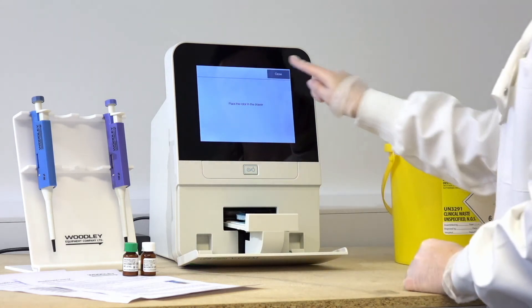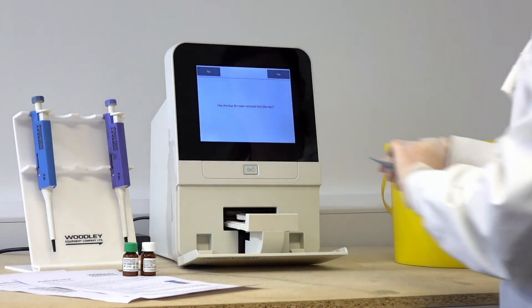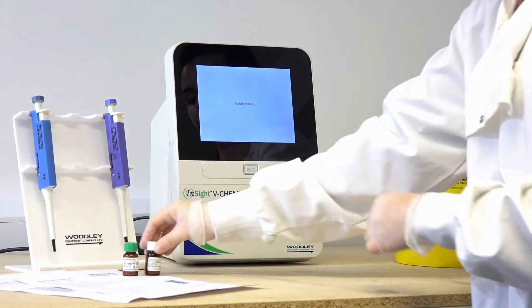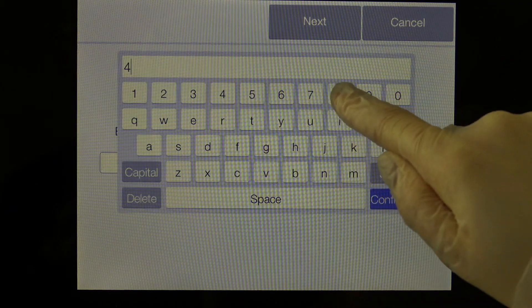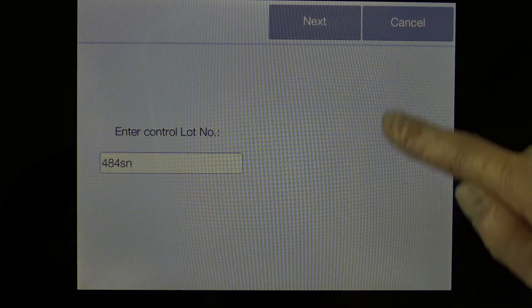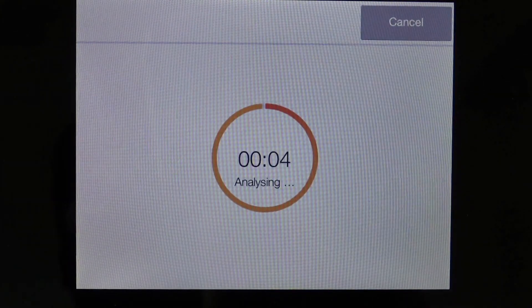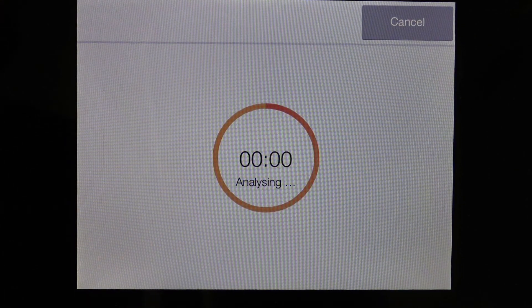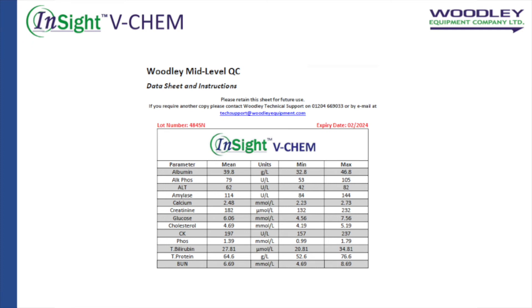Insert the rotor securely into the drawer and press Close. Ensure the blue film is removed from the rotor. Enter the lot number of the QC being tested. Analysis will now begin. Once analysis has completed, the QC results will be displayed on screen and printed out on the built-in thermal printer. Check that the QC results fall within the range as shown on the supplied QC datasheet.